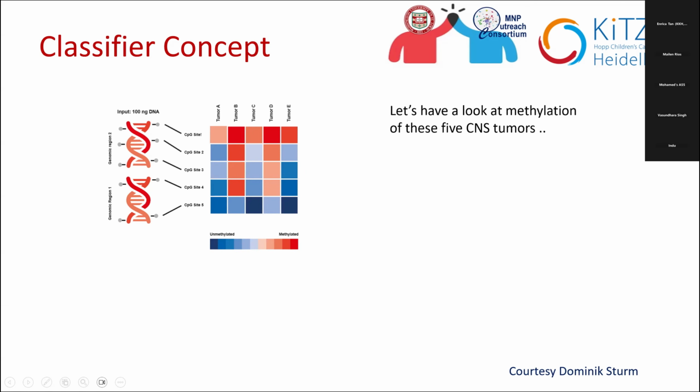So at the level of a single cell in a single gene, it's either methylated or unmethylated at a single CpG location. But when we study it from a tumor tissue, then we're not looking at a single cell, right? And this is why we would have a range of methylation spectrum with different shades represented here in the graph.